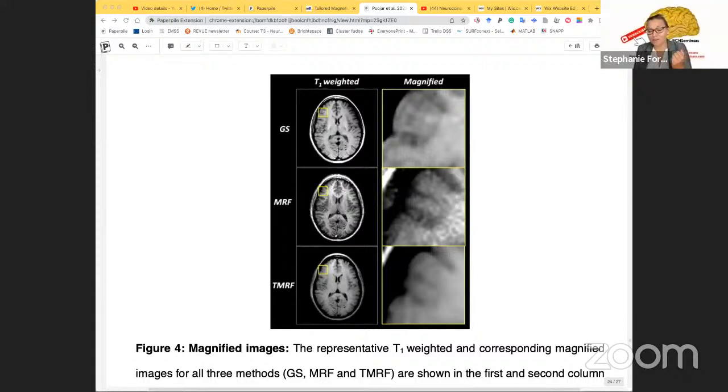The second question is about what the tailoring actually means. As I said, they used a tailored design for the different tissue types, using the relaxation parameters in the image. They used inversion pulses to suppress short and long relaxation components like fat and liquids, and that was done at different temporal time points.